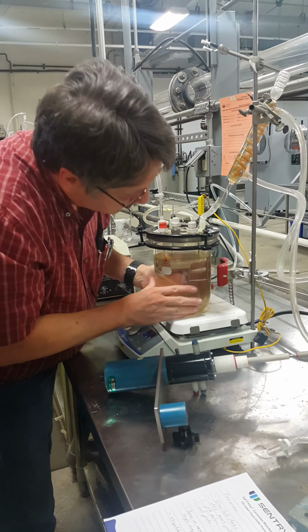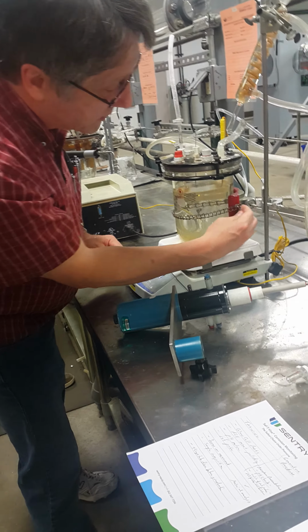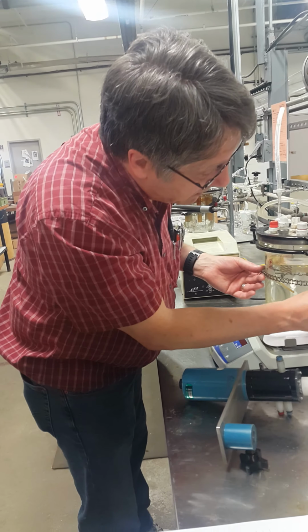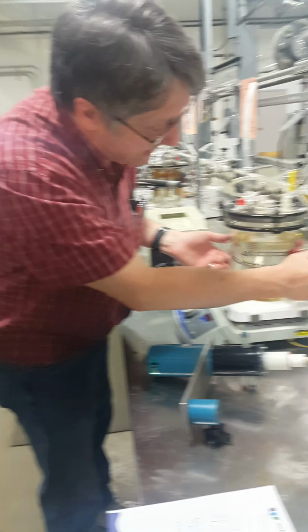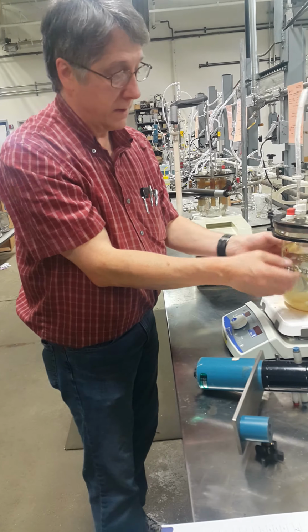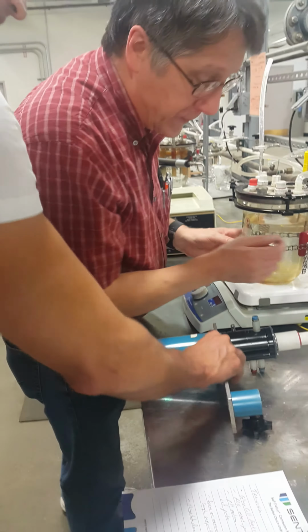When you're setting this up, you've got a clamp with a little chain that sets around there and goes onto that area. Let me loosen that up first. It doesn't need to be way tight, but just enough so it's not going to go anywhere. You'll see when you're testing that this is more important as to where this is sitting. So I want to set that up too.